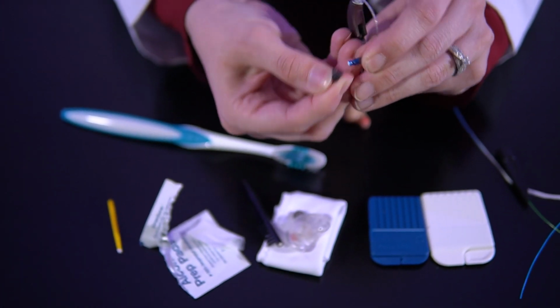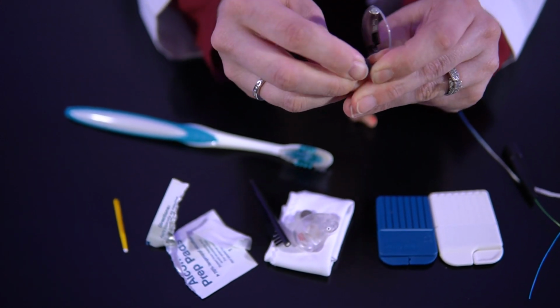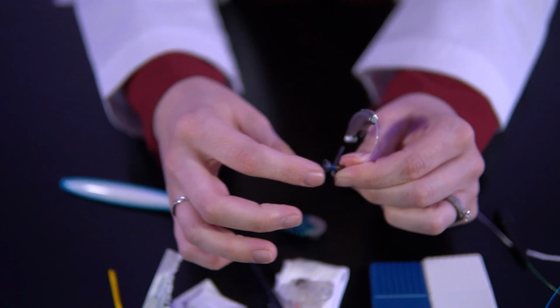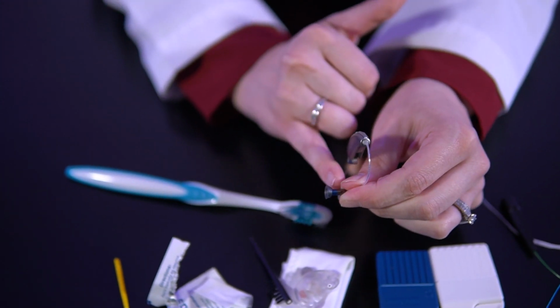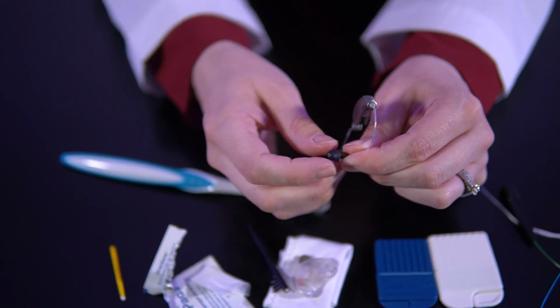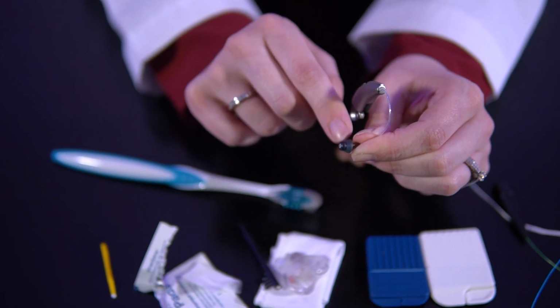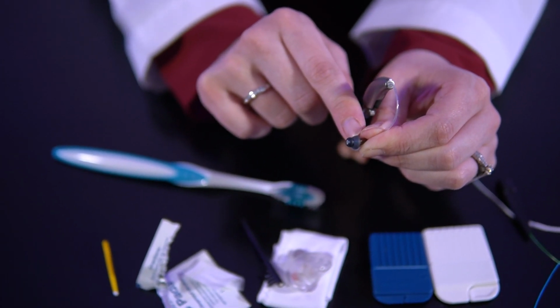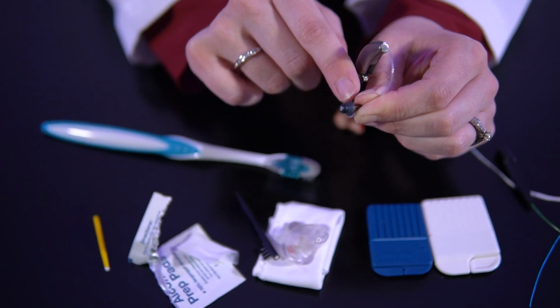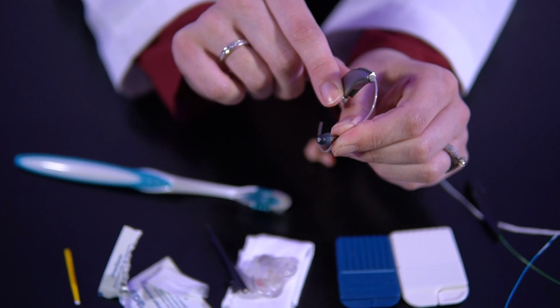and I kind of pinch it a little bit so I can push it back on. And I push it down really well, and I even give it a little tug. And see, I could pop that skirt up, but it's not coming off. So then I'll push it down again just to make sure it stays on. If you have your own domes at home and you switch them out, make sure you get them on really well.